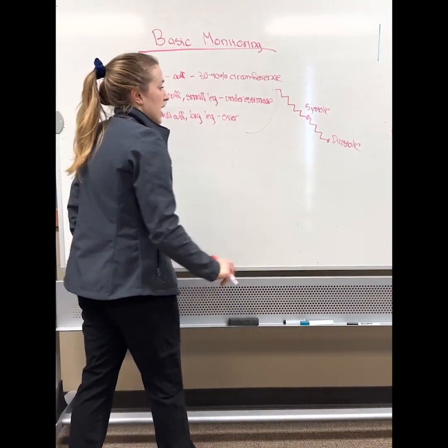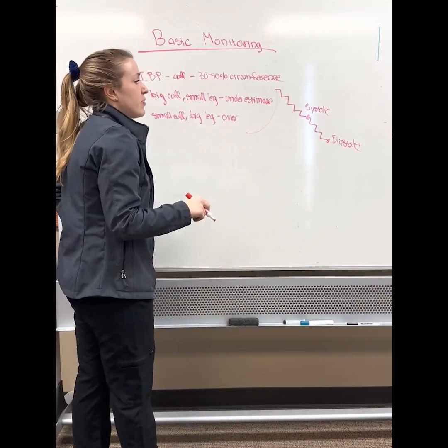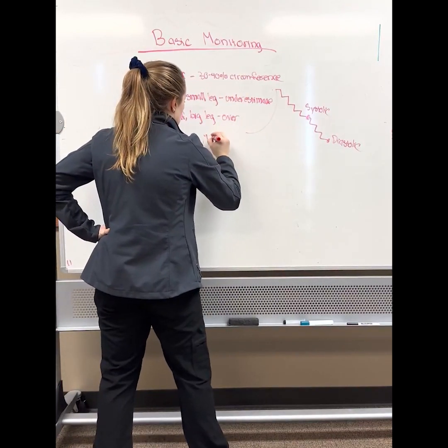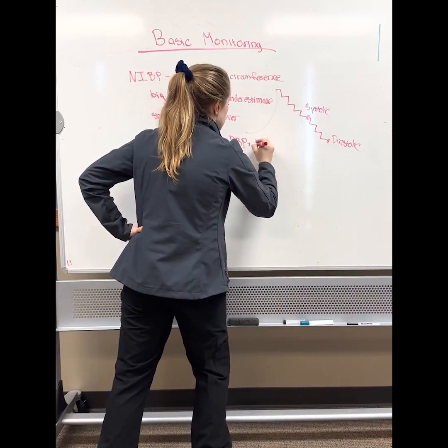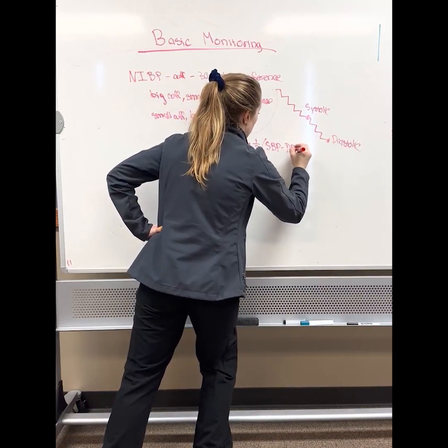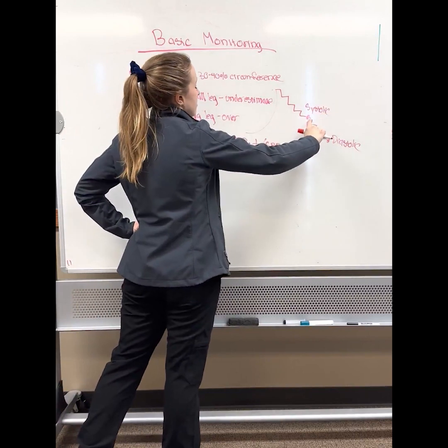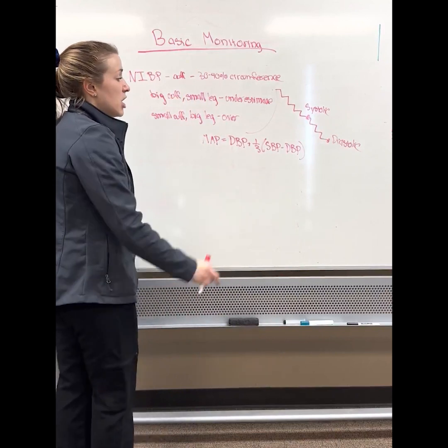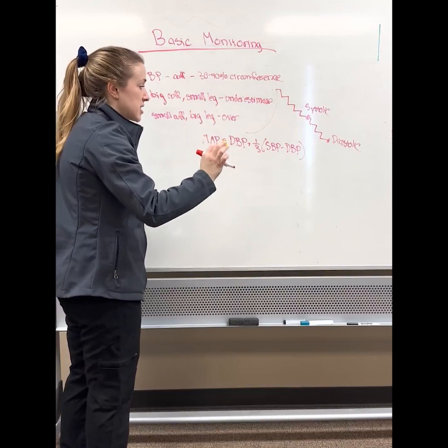So the systolic and the diastolic blood pressure are measured, but the mean blood pressure, or the MAP, is calculated based off an equation. The equation is: mean arterial pressure equals diastolic blood pressure plus 1/3 times (systolic blood pressure minus diastolic blood pressure). So the monitor measures the systolic blood pressure and the diastolic blood pressure, but it calculates the mean. So of the numbers on that screen for blood pressure, the mean is the most accurate because it is calculated.